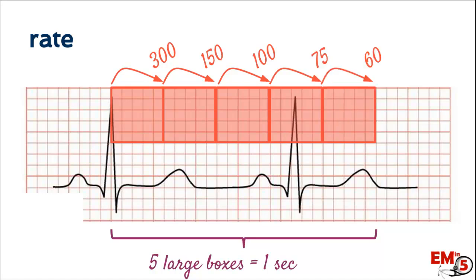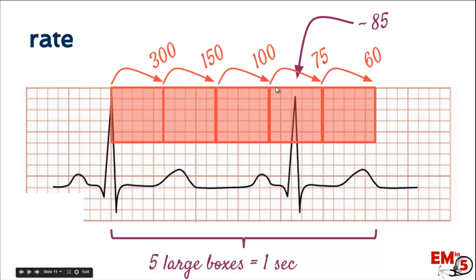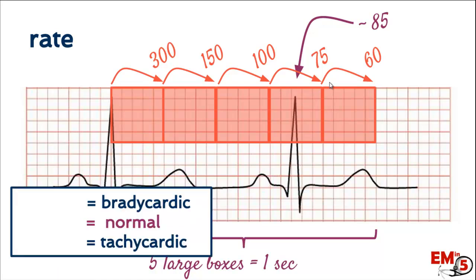Let's practice with this EKG. We have 300, 150, 100 — it's somewhere between 100 and 75, so we estimate about 85. Normal heart rate is between 60 and 100, with bradycardic being less than 60 and tachycardic greater than 100.